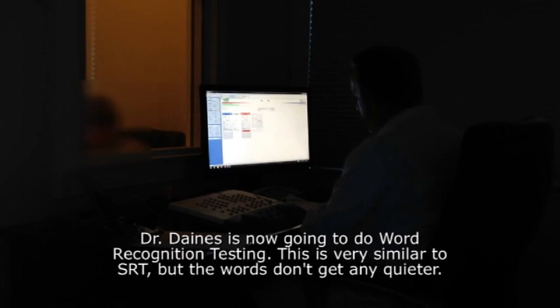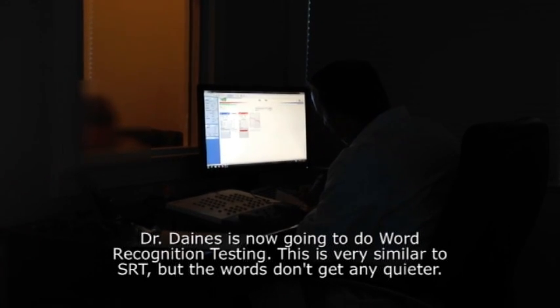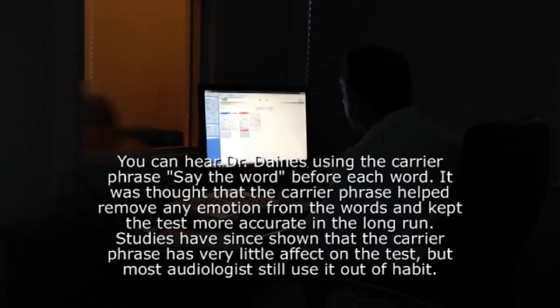Okay, you're doing great. Now, the words won't get any quieter. Just repeat them back to me the best that you can. Say the word base. Say the word mess. What was that one again? Say the word cause.